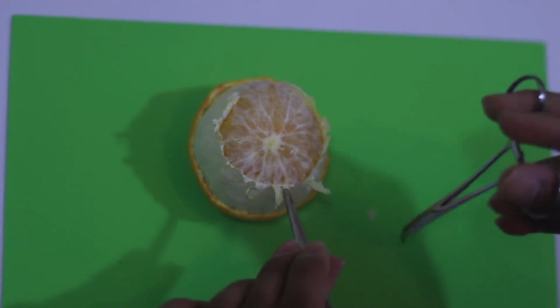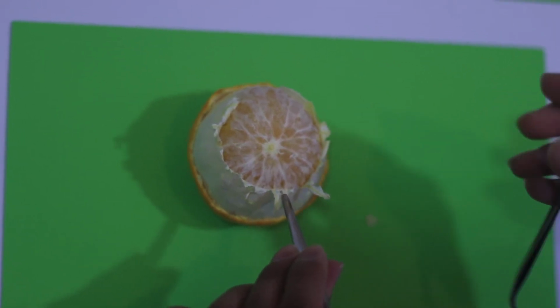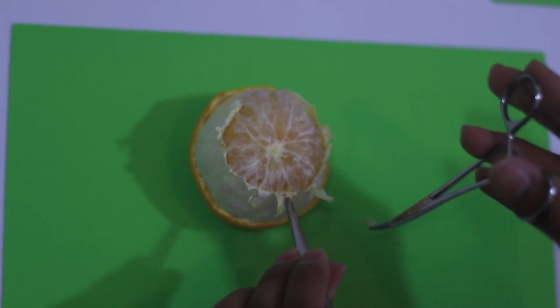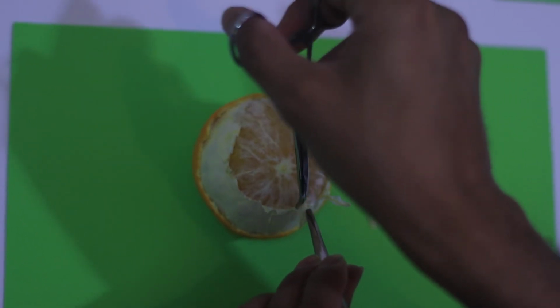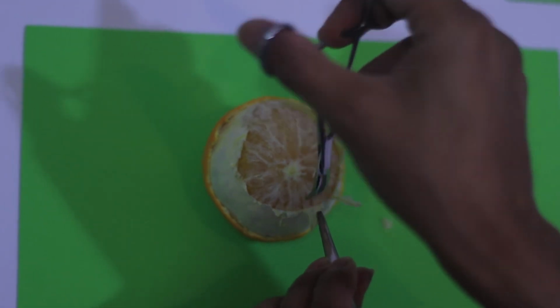Another example here. So what I will do, I will just rotate it and start the dissection, and so on. That's it.